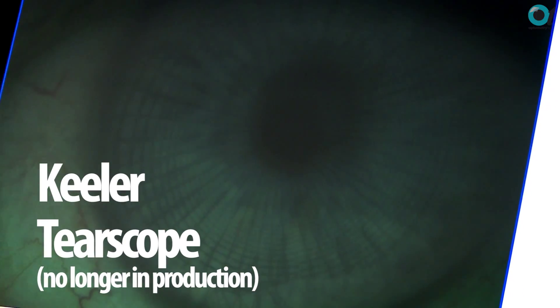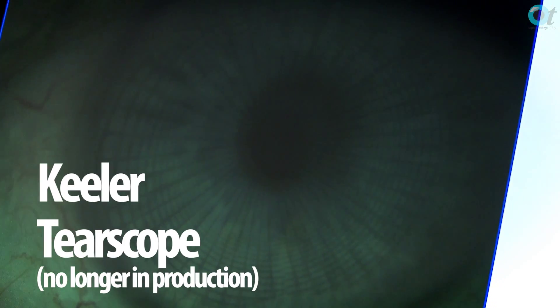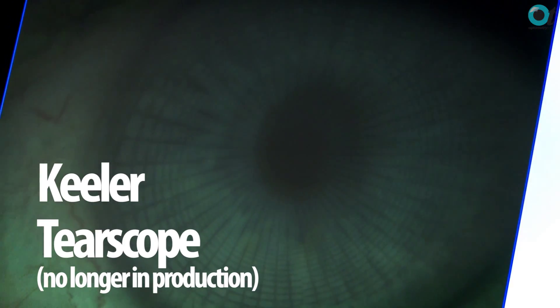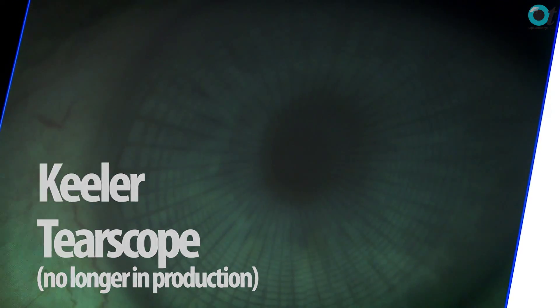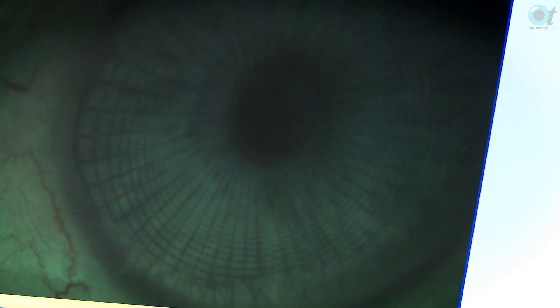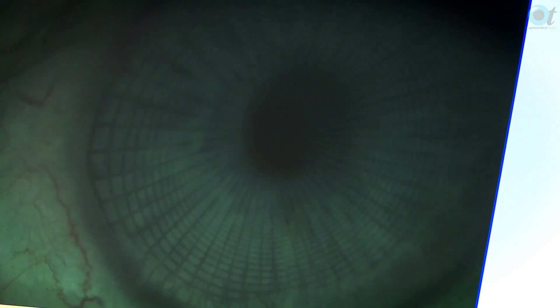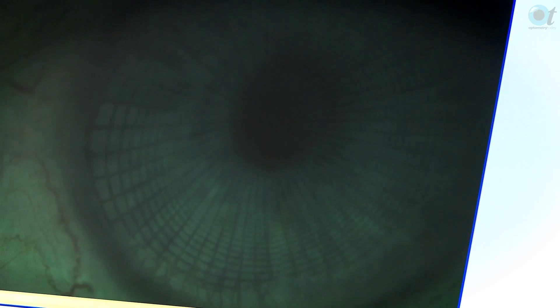Okay, blink for me and stare as long as you possibly can and try not to blink. What we're trying to do is measure when those gratings — those mires — distort. There we go. The patient had to blink then because the tear film had broken.